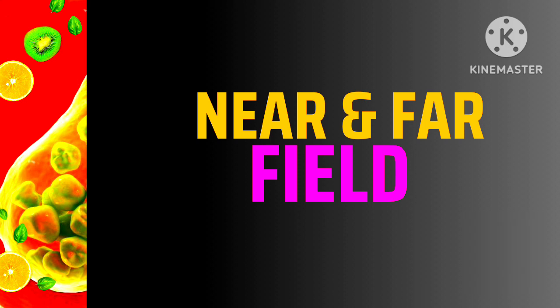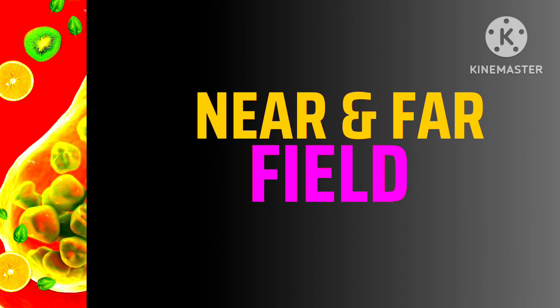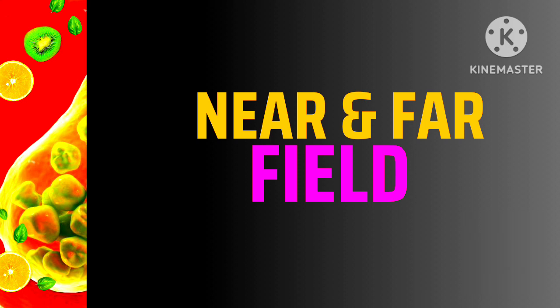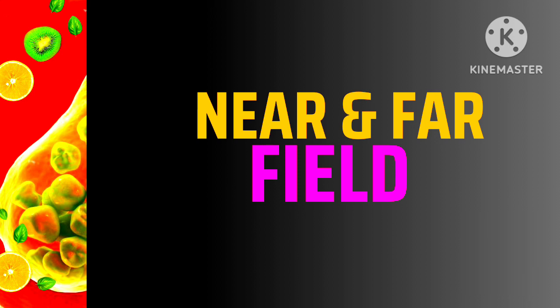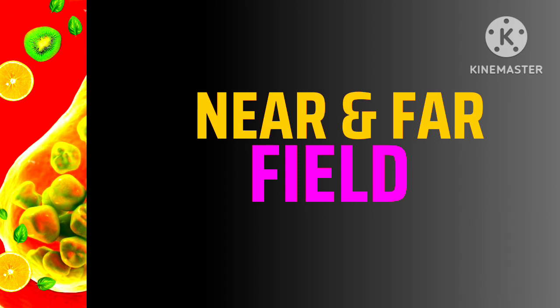Now discuss about near field and far field of an image. Whatever is struck first by the beam is anterior or near field. Whatever is struck last by the beam is posterior or far field. Remember, anterior field is near field and posterior field is far field.